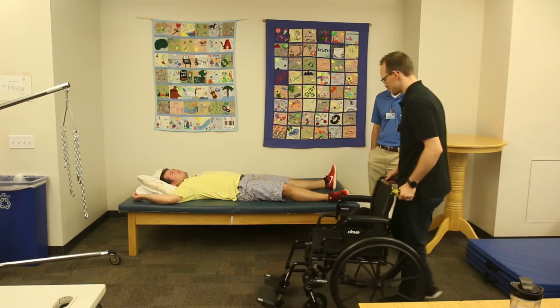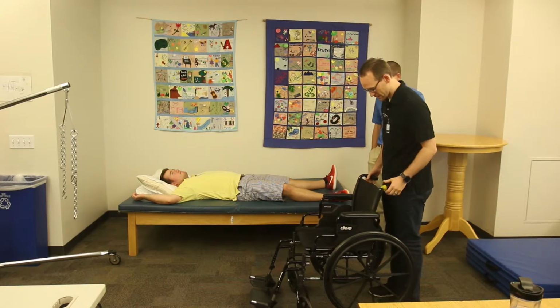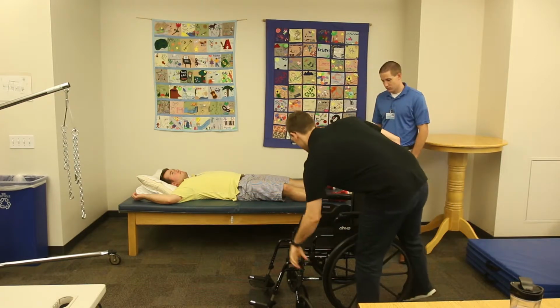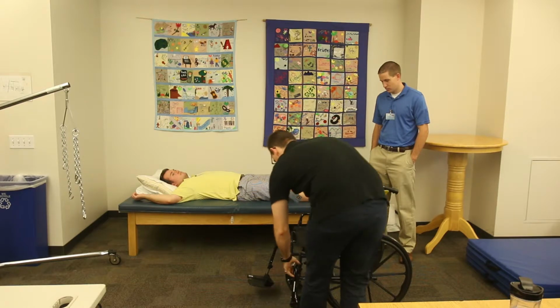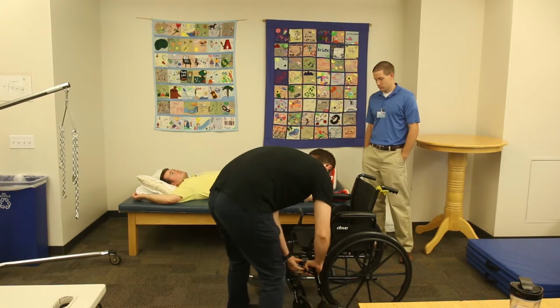Make sure that the chair's in here. We'll need that so you can get to lunch. I'll lock the chair. Then I'm gonna take these off real quick.